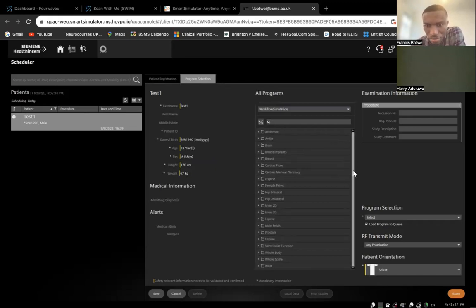So which type of exam are you going to do? Is it cardiac? Is it brain? You select. Let me use brain first. Then we can come back to the cardiac.